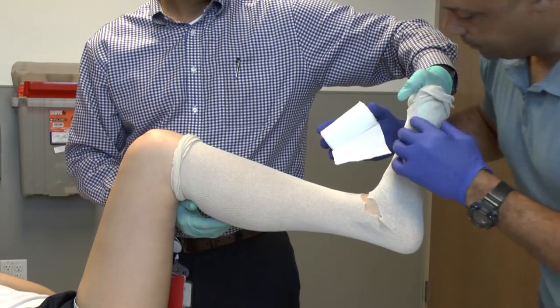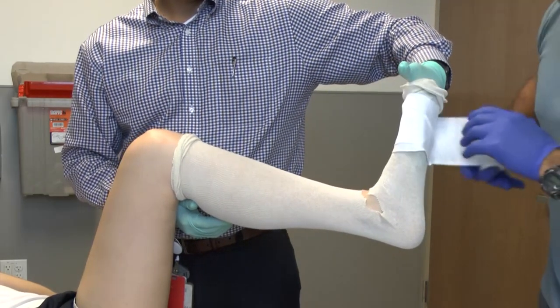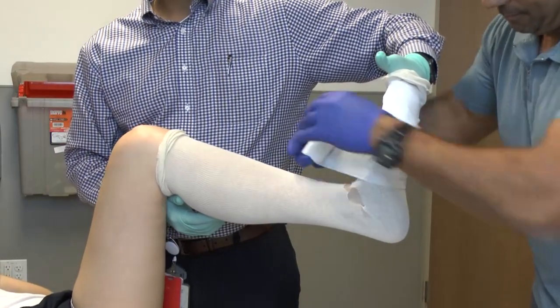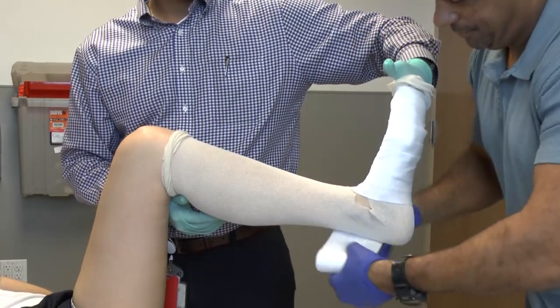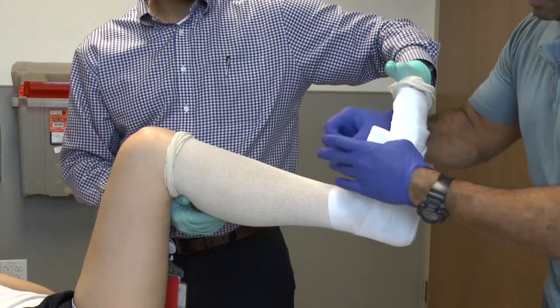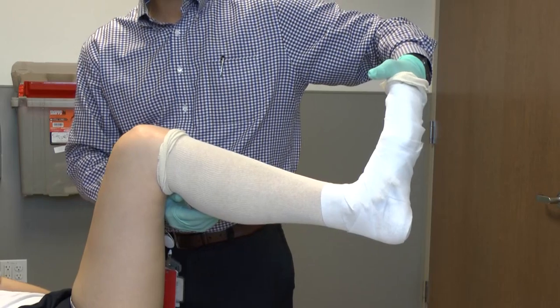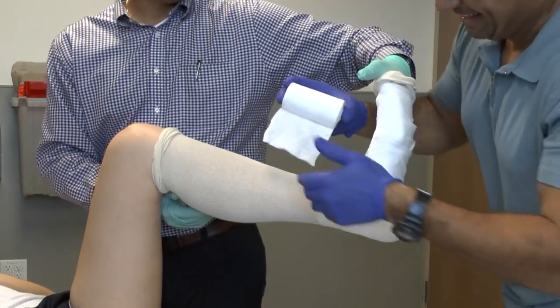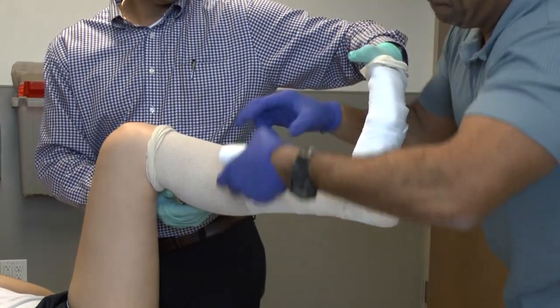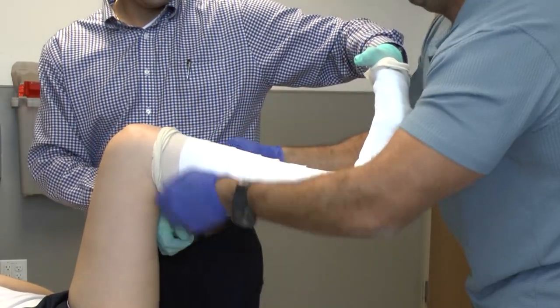Once you have your stockinette in place, you will then apply the webril or sheet cotton so as to cover at a rate of about one and a half layers deep all around the foot, ankle, and leg. Be sure to well pad over the toes and at the proximal tibia. It's also important that you tear the cotton as you pull it into place, so that it folds nicely and lays flat against the skin and all the contours of the child.